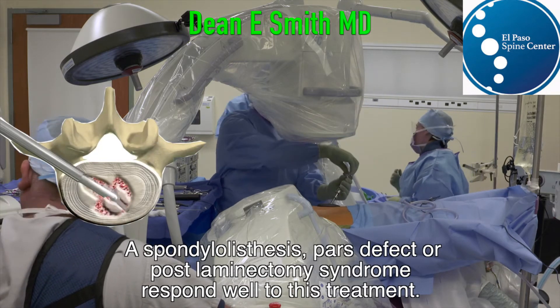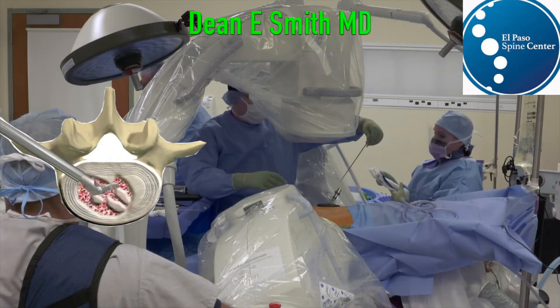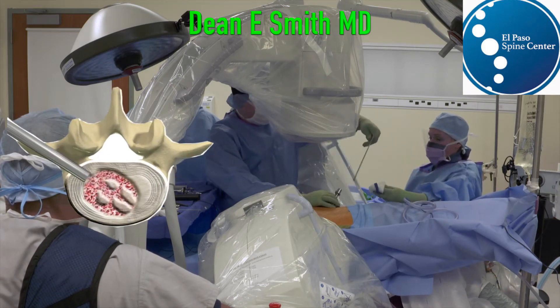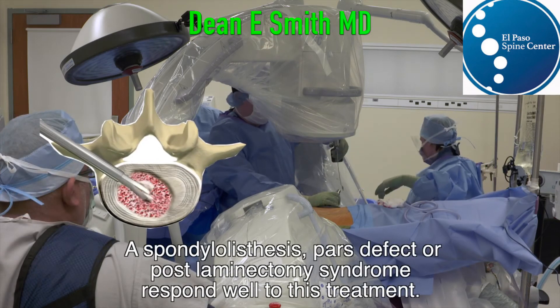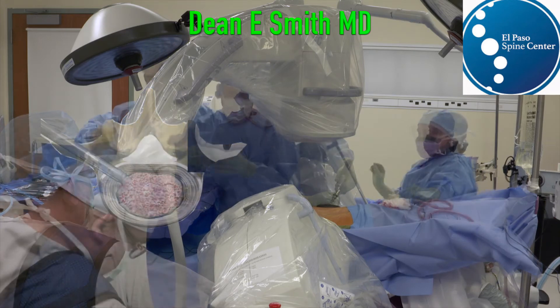We place a mesh bag that is filled with a combination of bank bone and stem cells, and it leads to normal spinal alignment and restores the height of the disc space, alleviating the pressures on the nerve.